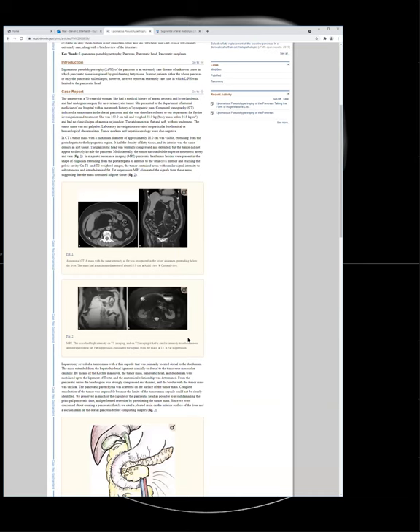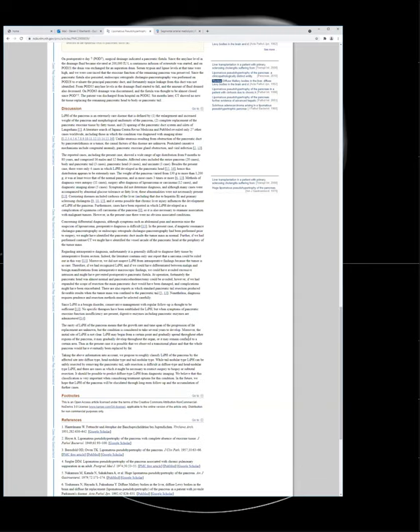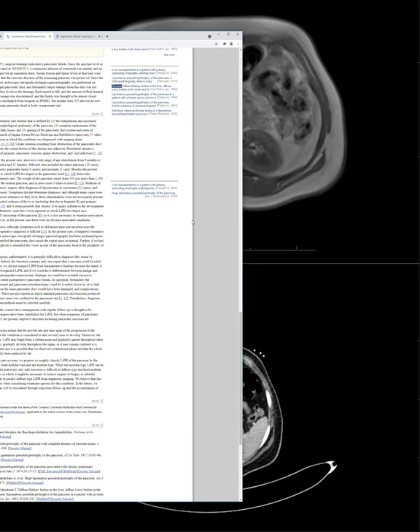But it sounds like the islets are preserved. Yeah, it's interesting. Enlargement and increased weight of the pancreas, morphological complete replacement of pancreas exocrine tissue by fatty tissue with sparing of the duct and the islets. It's a weird diagnosis and it's rare. So maybe you'll never see it, but I did. Radiologists see rare diagnoses, don't we?